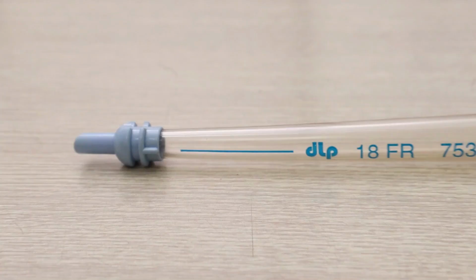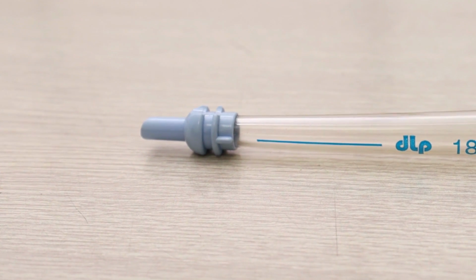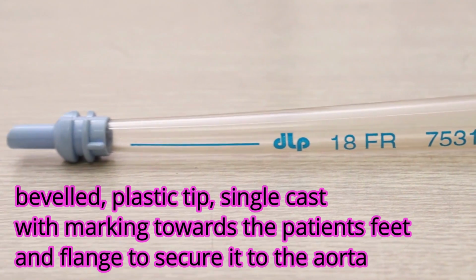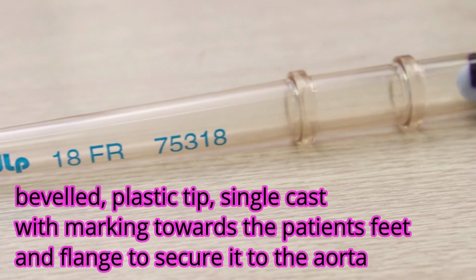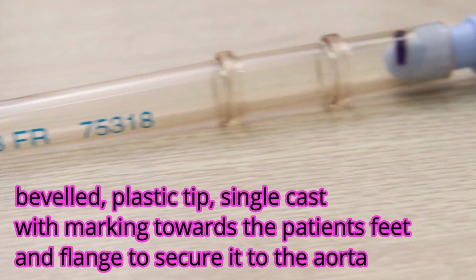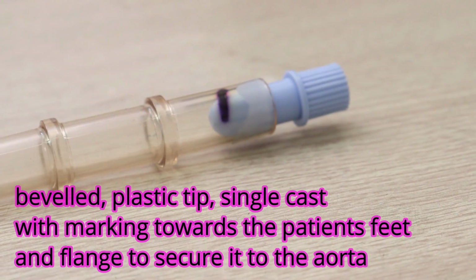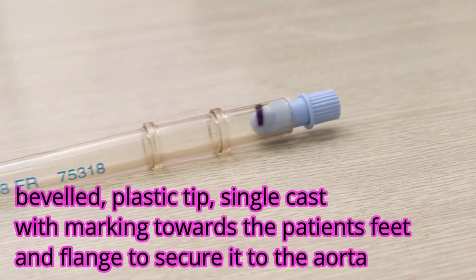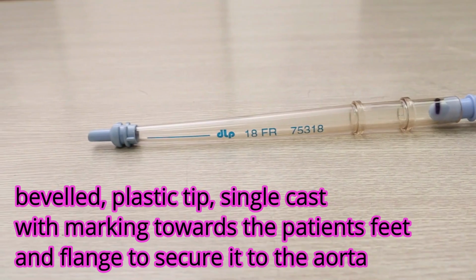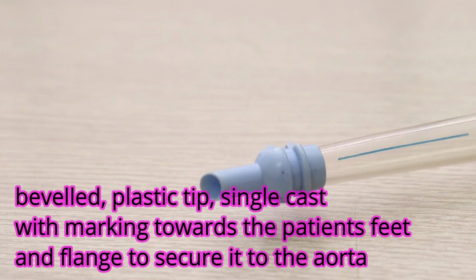You can still use this cannula for the internal jugular vein as well, not necessarily that it has to be used for arterial. This is another type of cannula, as you can see, not wire reinforced. It is well marked. It has a beveled tip. It's a single cast. Again, you can see there is place for the snugger to be tied whilst the cannula is in the ascending aorta. You can see there is room for the cannula to be tied with the help of the snugger.